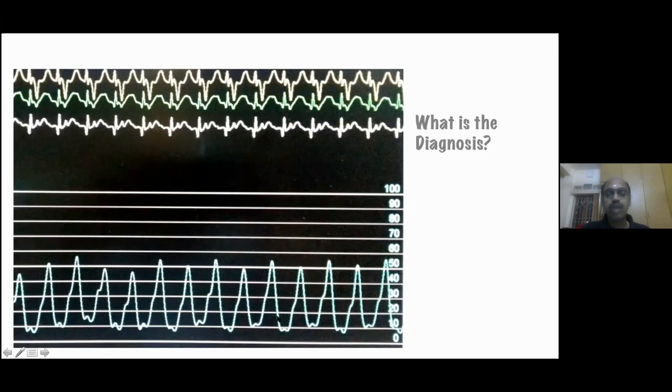An example of a pulmonary artery pressure trace. Here the pulmonary artery pressure is coming close to 50 to 55 millimeters of mercury, with diastolic touching very low levels of 5 to 6 millimeters of mercury. This means there is an extremely wide pulse pressure. Possible two contributing reasons: one is severe pulmonary regurgitation, and second is peripheral pulmonary artery stenosis bilaterally.